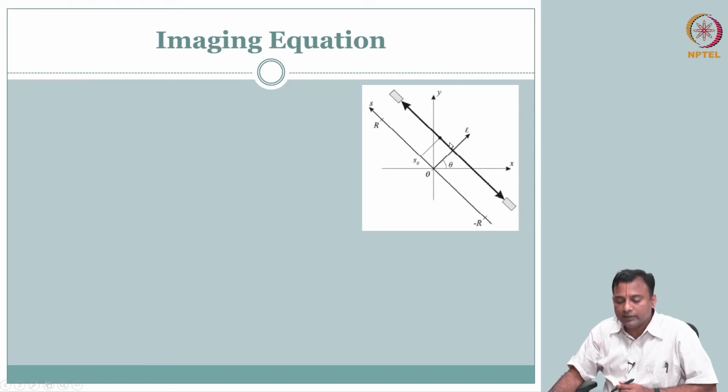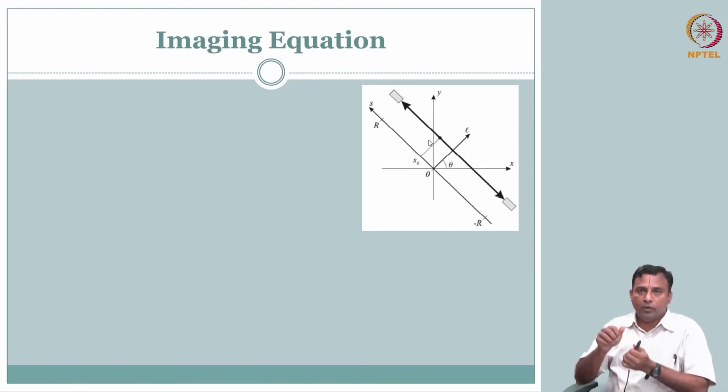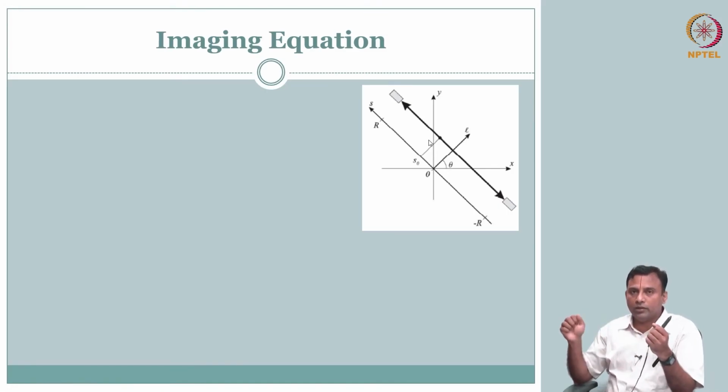So, along this line there is a radioactivity that is happening. You have this n number of photons, right, the gamma photon coming hitting here, gamma photon going hitting here. Okay. So, before we jump in, let us see, it is a probabilistic thing, right. Your decay gives your positron, positron catches an electron and gives photons in two directions, right, 180 degrees apart, but it can be in any direction. So, the number of photons that you detect is going to have some probability, right.